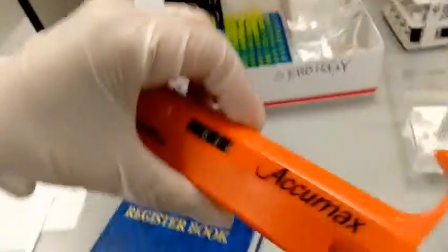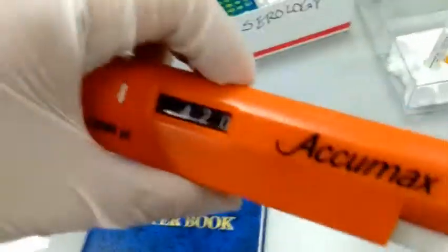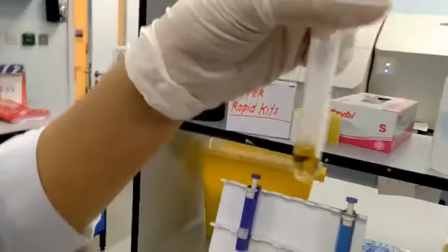400 UL of the samples. 400. Of the sample. So this is what we are talking about.